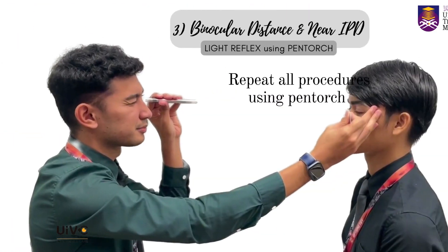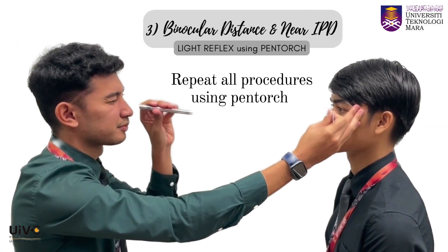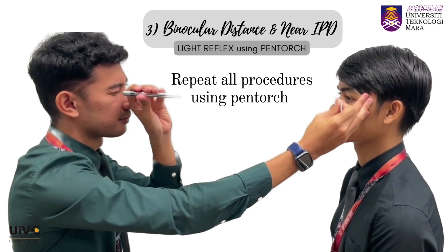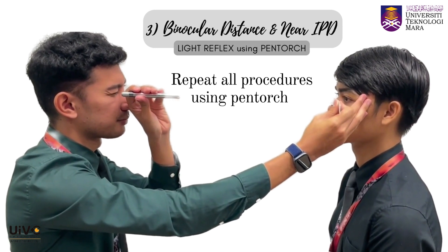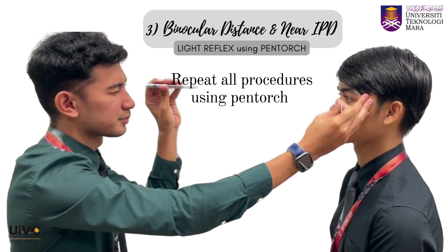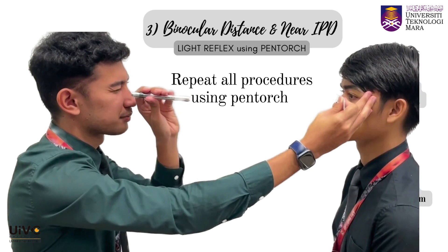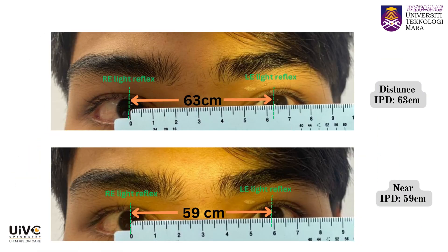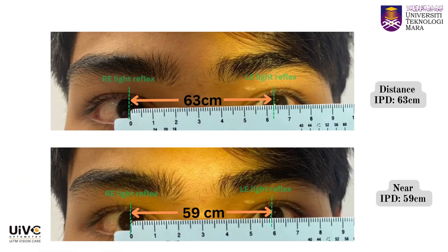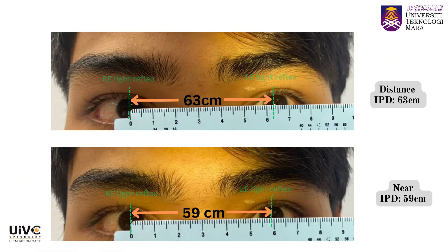Repeat all the procedures using the pan torch. The landmark will be changed from the limbus to the light reflex at the centre of the cornea.